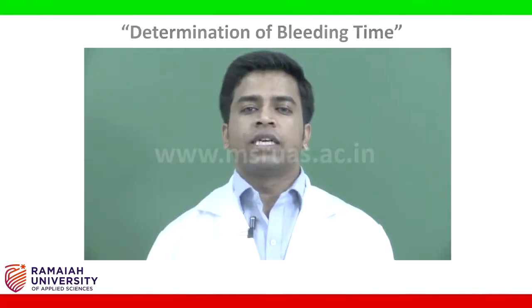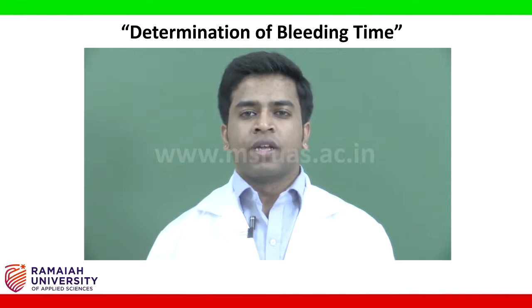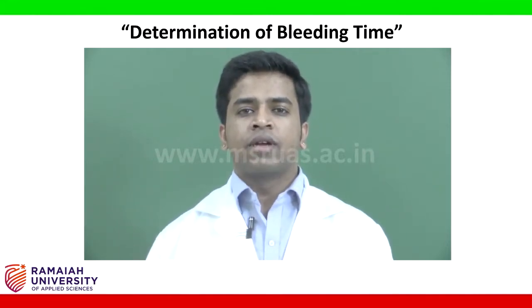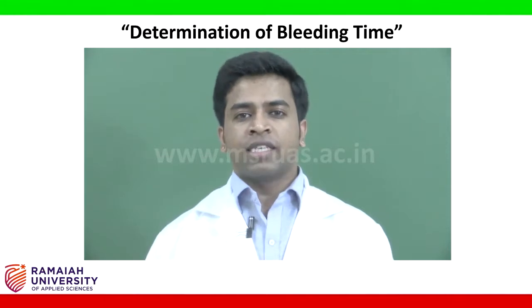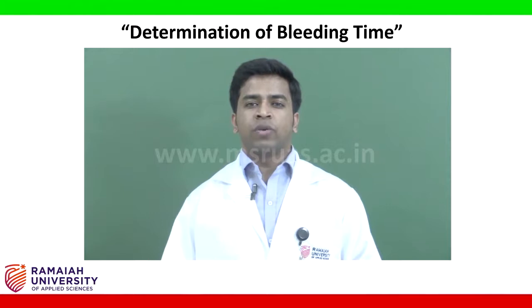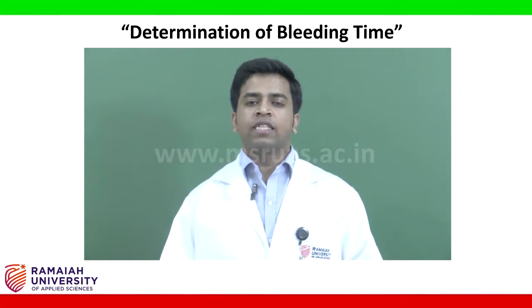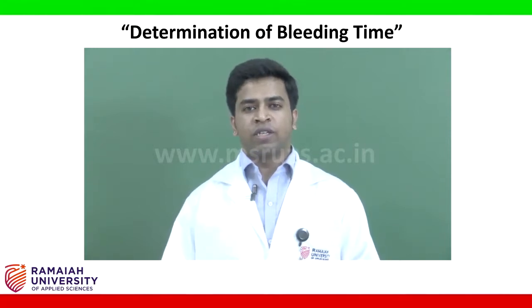Hi students, in this experiment we are going to study about bleeding time. The aim of this experiment is to determine the bleeding time and to indirectly assess the platelet function. Bleeding time is the time interval between the skin puncture and the spontaneous unassisted stoppage of bleeding. The bleeding time test is a useful tool in the study of platelet plug formation.